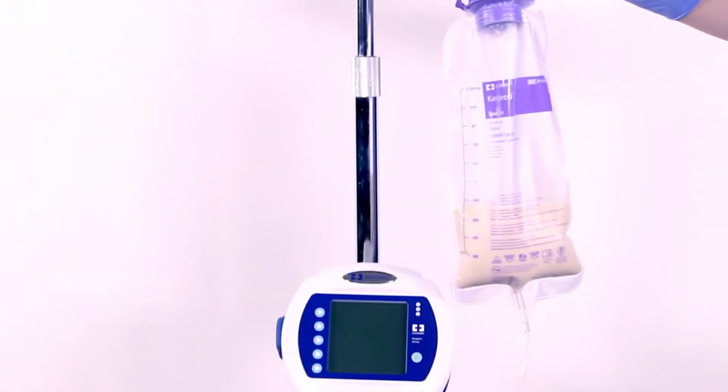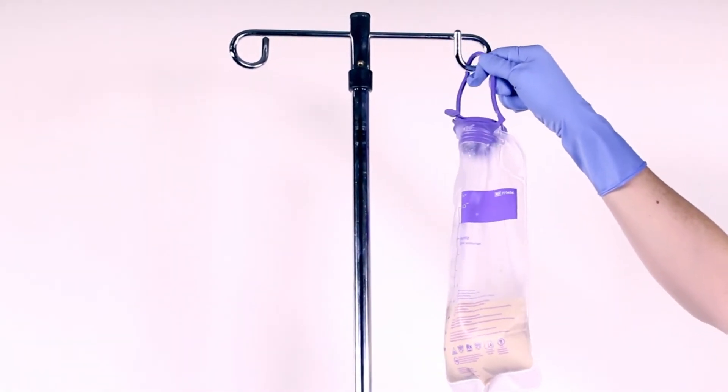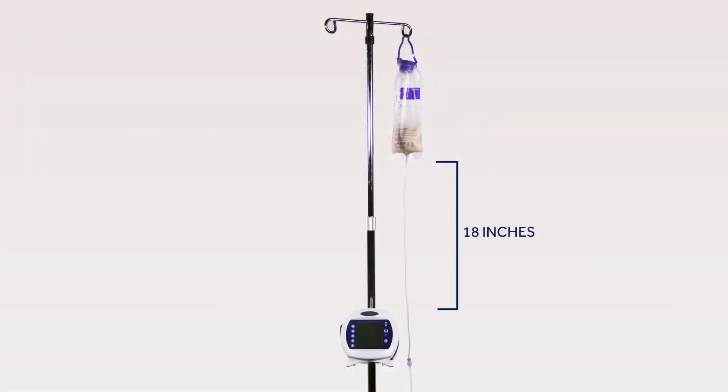In order to achieve proper accuracy, the bottom of the feeding set bag must be 18 inches above the top of the feeding pump. Failure to hang the set to the proper level can result in inaccurate system feeding.